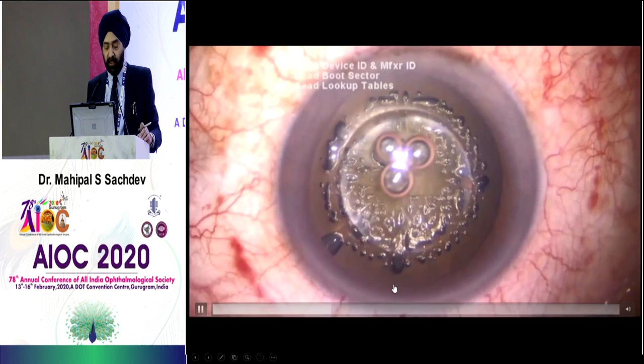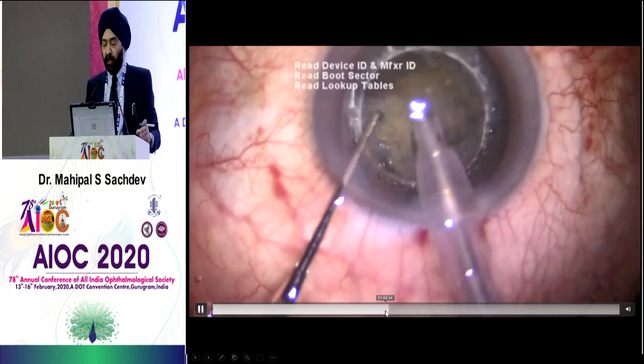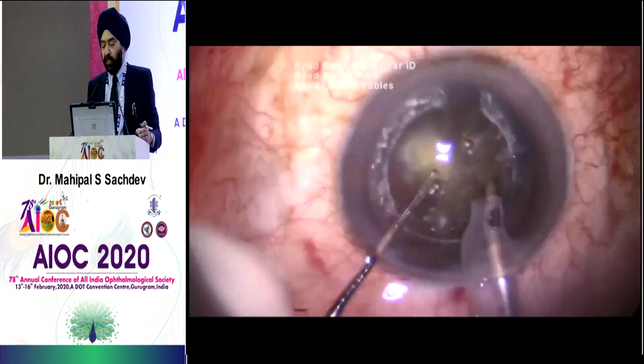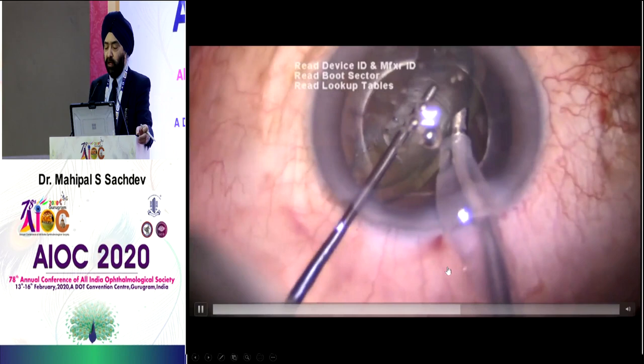So you see here, good capsulotomy. There is so much of nuclear emulsification that you don't need much. You don't do any hydro procedure because pneumo is enough. And you can see that I have been able to remove the entire nucleus without even rotating it. Now, this is the last piece which I am disassembling and taking out. Once I take this out, you can see in this particular case, as things are moving, this is going to be the defect, but I have a huge epinuclear cushion.